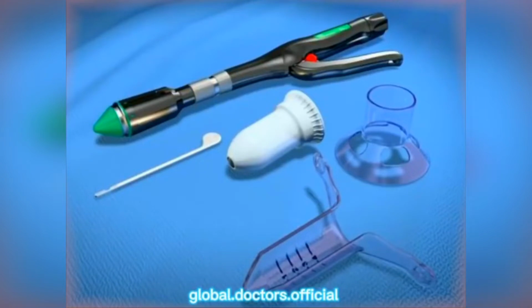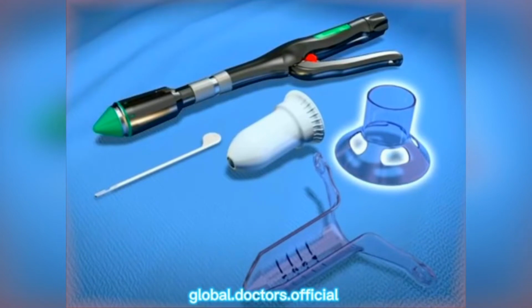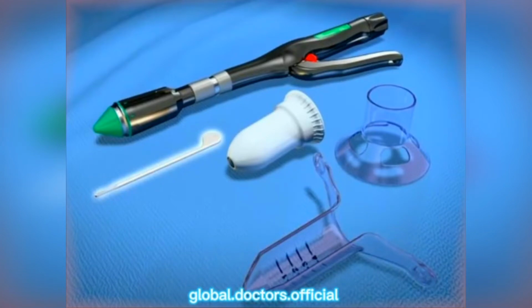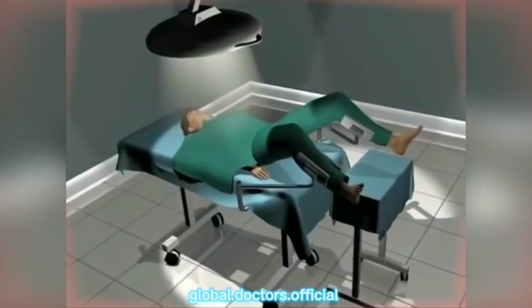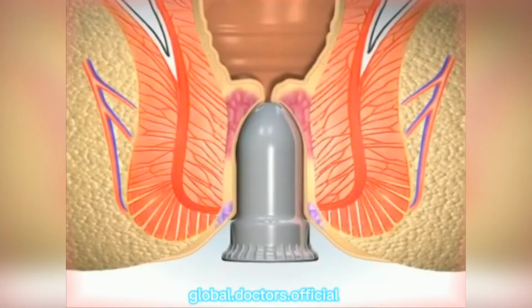PPH set of instruments. The kit includes a 33mm hemorrhoidal circular stapler, a circular anal dilator, a purse-string suture anoscope, and a suture-threader. The patient is positioned in a prone jackknife or lithotomy position. The anal verge is gently massaged and dilated before inserting the dilator.